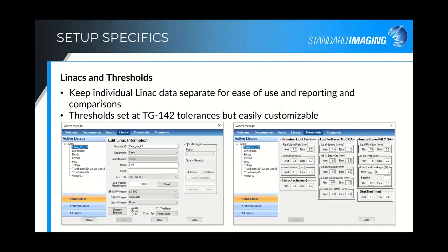Setting up your LINAC is very easy. You set your machine ID in your department, the manufacturer, and whether you have a 6D or 3D couch. On the right is the thresholds page, which defaults to TG142 recommendations but can be loosened or tightened as you see fit within your department — some tests you might want to tighten up, others you may want to loosen depending on your preferences.